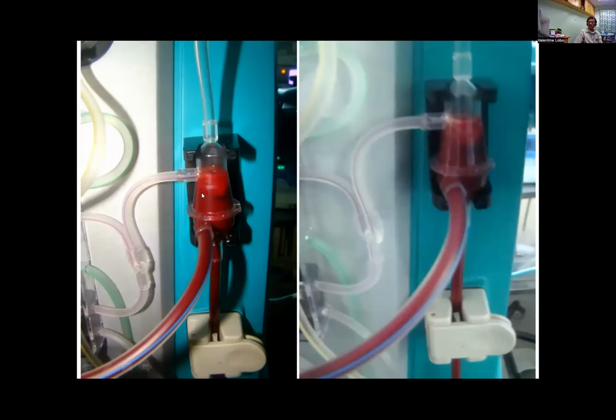However, if at a point in time the bag was not changed, or the bag was changed well after it got empty, air could be delivered in by the return line into this chamber. An air-blood foam gets formed, and some of these foam bubbles enter the air detector just below this chamber and trigger off the air alarm.